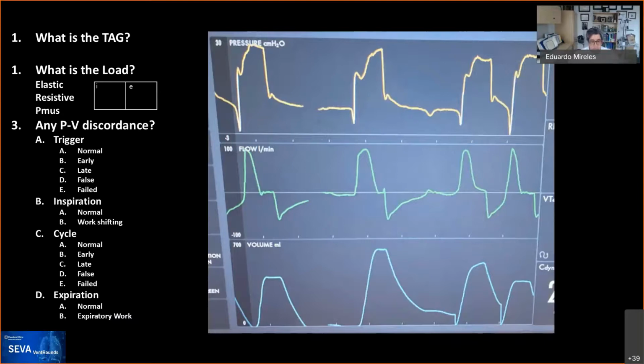I'll give you another minute. By this time, you guys are experts in cycling, but this one has a lot of data.